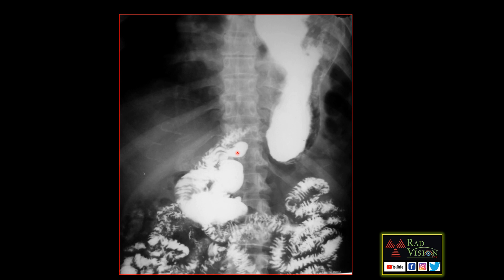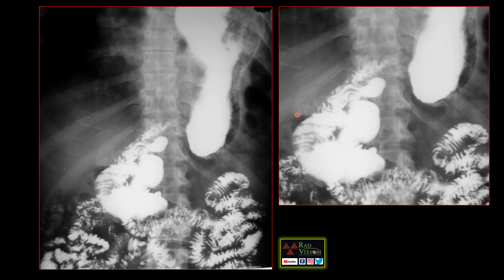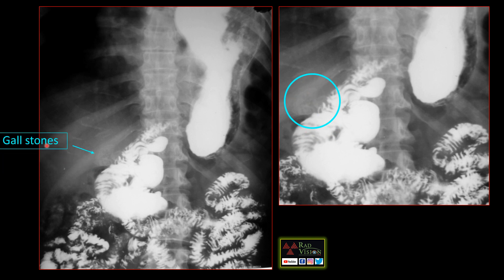What are the subtle findings in this case? When you look carefully there are subtle calcified foci noted in the right hypochondrium. I will zoom the image for you. These are the subtle calcified foci in the right hypochondrium, probably in the gallbladder area. This circle highlights the calcifications in the GB area. These are nothing but gallstones.